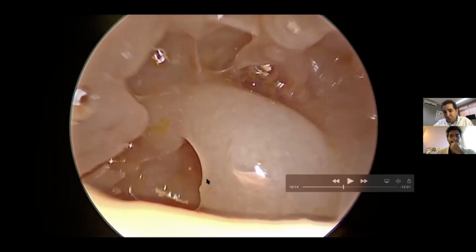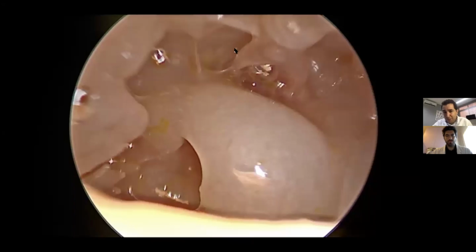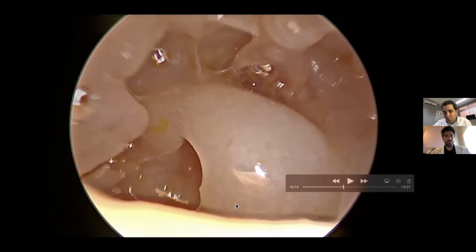This region between the anterior pillar and the jugular bulb, which is going to be here, is called the funiculus, the end, the fin of the retrotympanum. So the retrotympanum starts here at the oval window niche and goes all the way down to the funiculus. So we have sinus tympani, and below it, from the subiculum to the funiculus, we have the sinus subtympanicum, which is below sinus tympani.